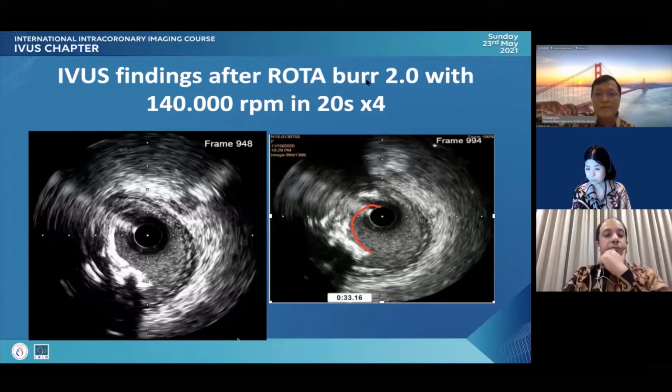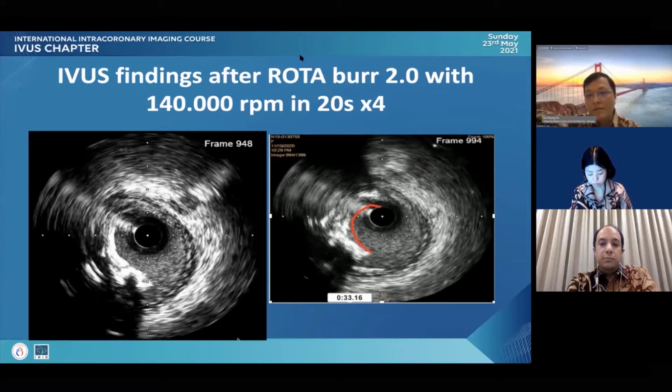What do you think? Thank you for the very good question about the temporary pacemaker. In our center, at the beginning, when we ran rotablation, we usually used a temporary pacemaker for the RCA rota run. But after a long time, when we have more experience with rota ablation, we seldom use the temporary pacemaker for the rota run, except in patients at very high risk.